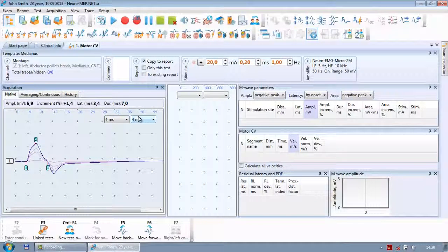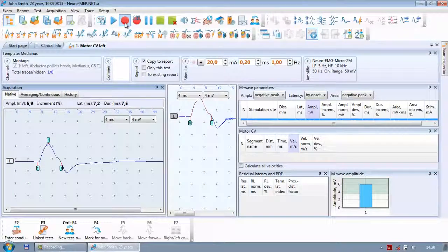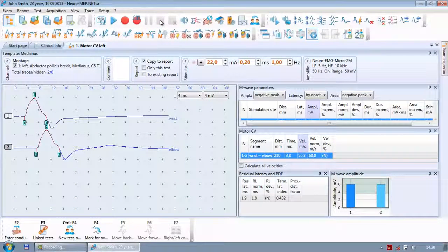It means I'm at the supramaximal level, and I press stop acquisition and save result. Okay, now I am ready to make a next point. I move electrode to the next stimulation point and make stimulus. Okay, increase. Okay, not growing. Keep. Okay, now I have two curves.